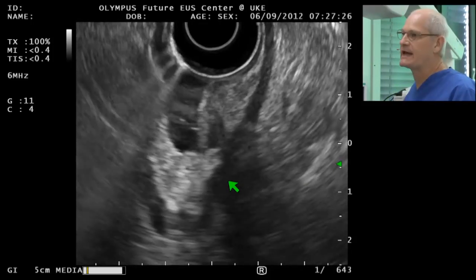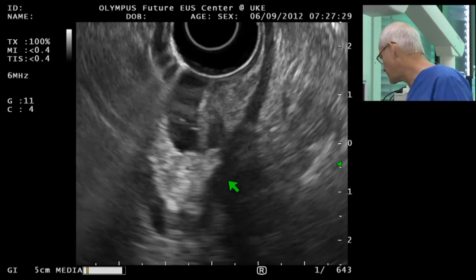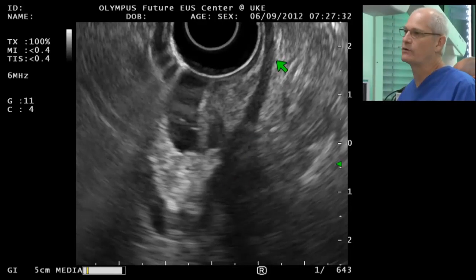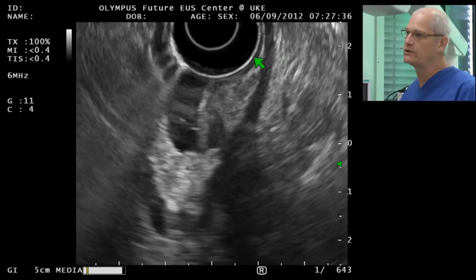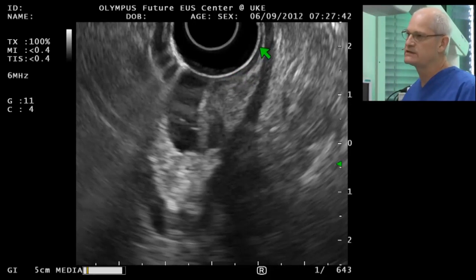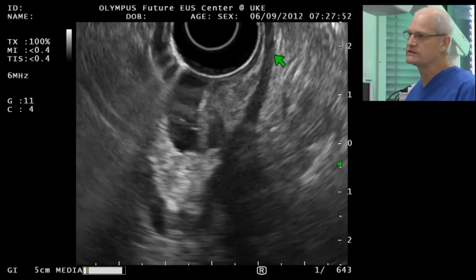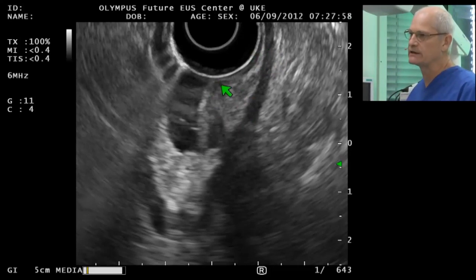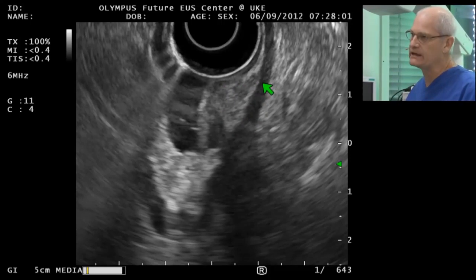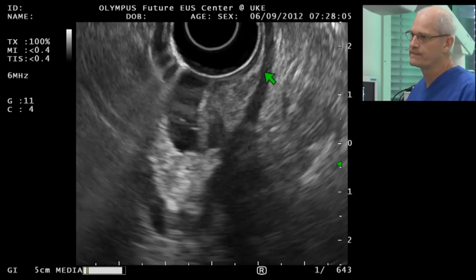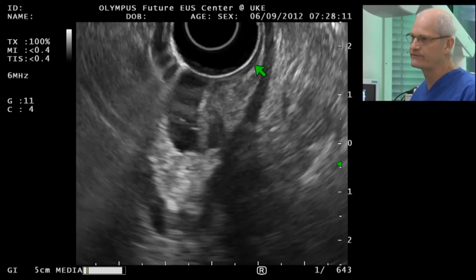We can freeze it now. For submucosal lesions, the key is what I call a transition zone. You can see here a border echo — this is the mucosa, this is the submucosa, and this is the muscularis propria. This is the transition zone between the normal gastric wall and the lesion. The muscularis propria is not involved, and this is an inhomogeneous lesion emanating from the submucosa.